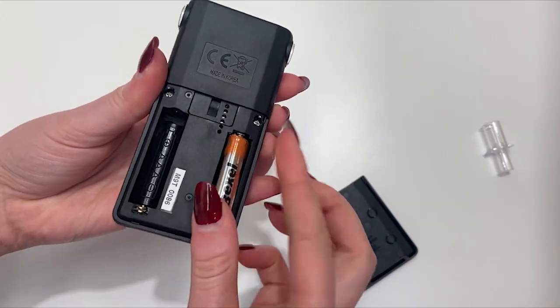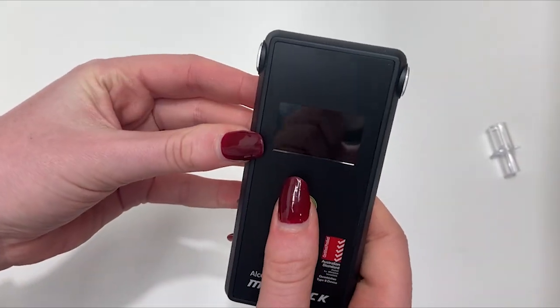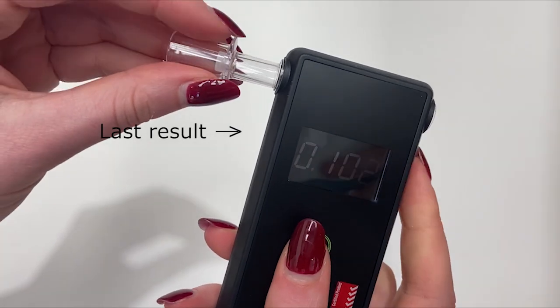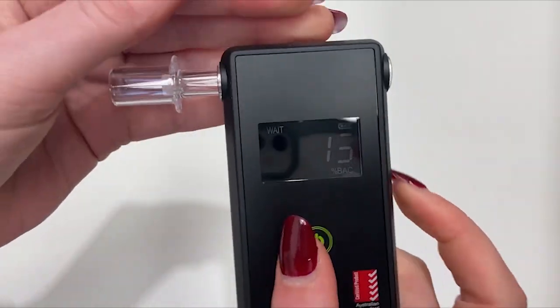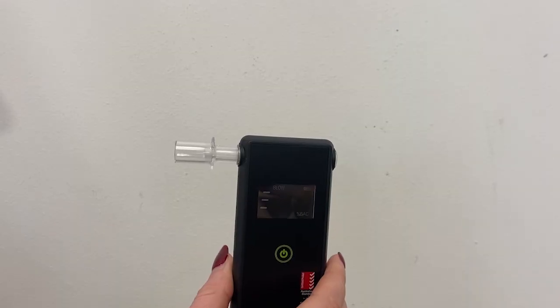Insert alkaline batteries and hold the power button for two seconds. The first number that appears is the number of uses on the device. Then appears the last reading from the previous breath. The Maverick then counts down from 30. Insert the mouthpiece and blow until you hear two beeps.